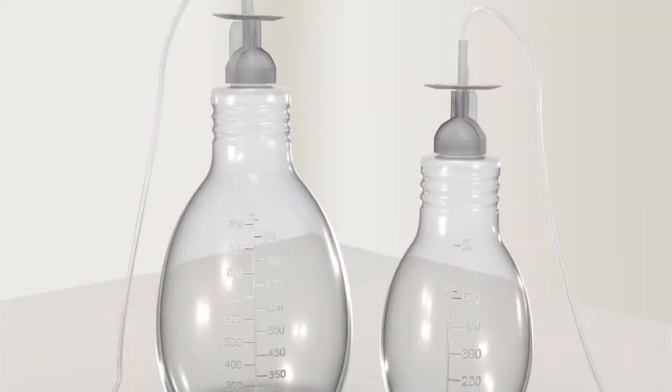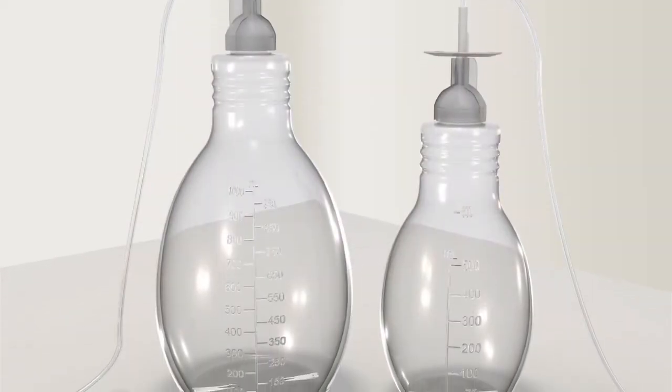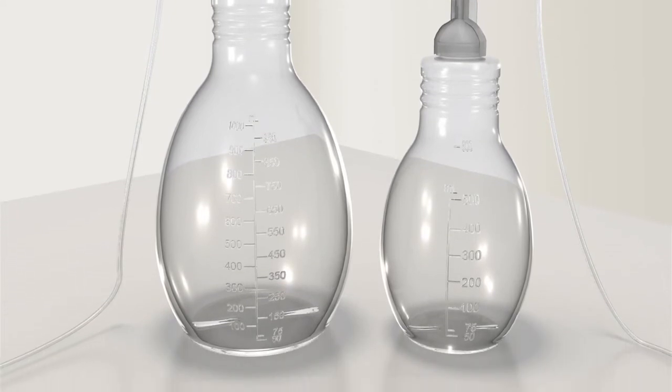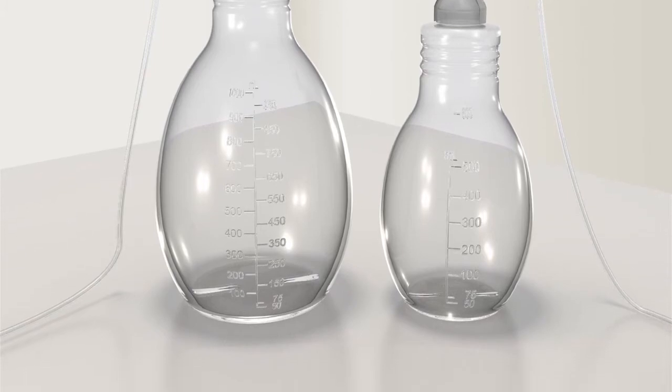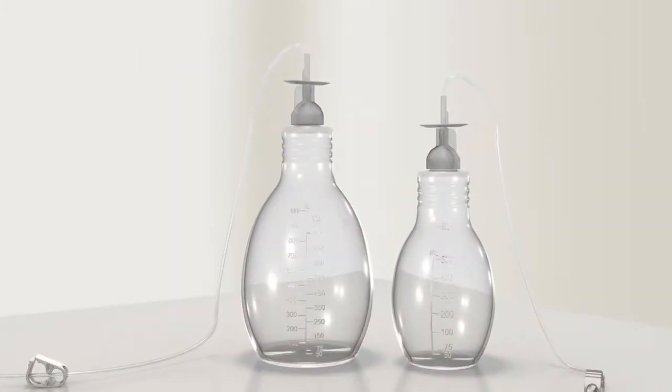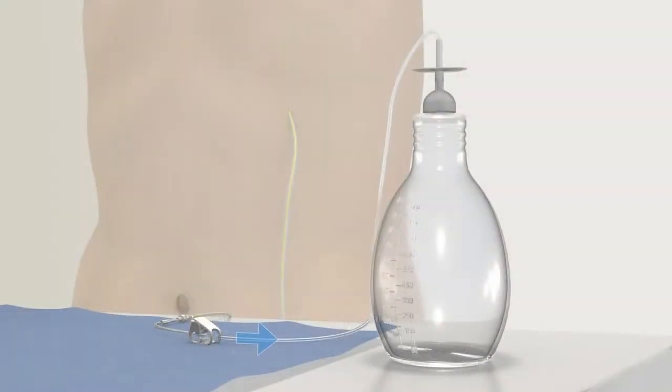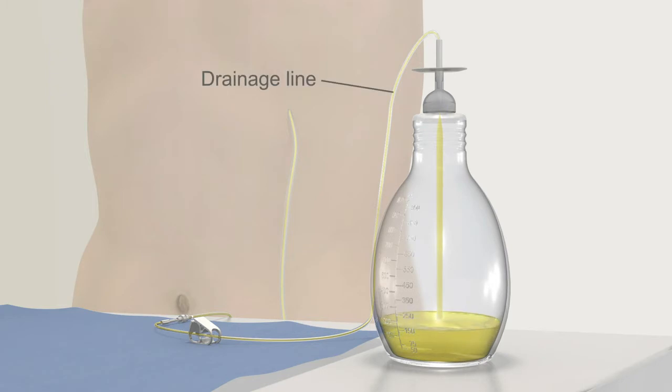You'll drain your fluid into PleurX drainage bottles specifically designed for use with your PleurX catheter. These bottles come in two sizes, 500 milliliters and 1,000 milliliters. Preparation and use of each bottle is the same regardless of size. The active vacuum technology in the PleurX bottles provides suction for drainage and allows you to place the bottle wherever it is most convenient during each drainage procedure. The drainage bottle features a drainage line, which you will connect to your catheter when you drain. The color of the fluid drained may vary.